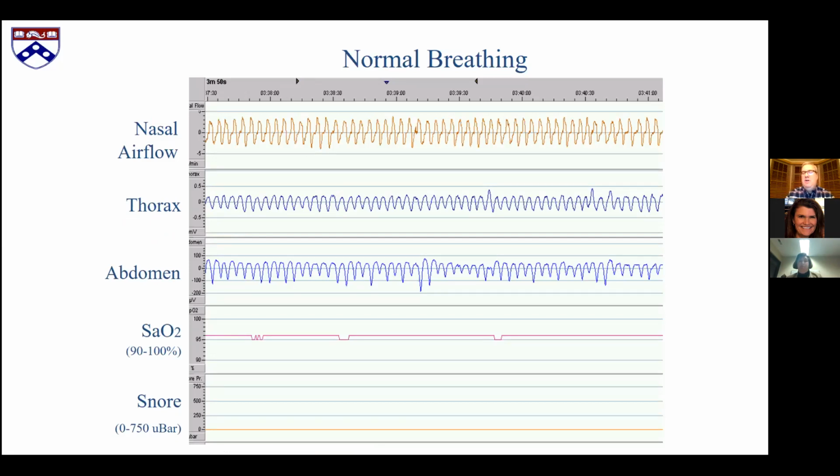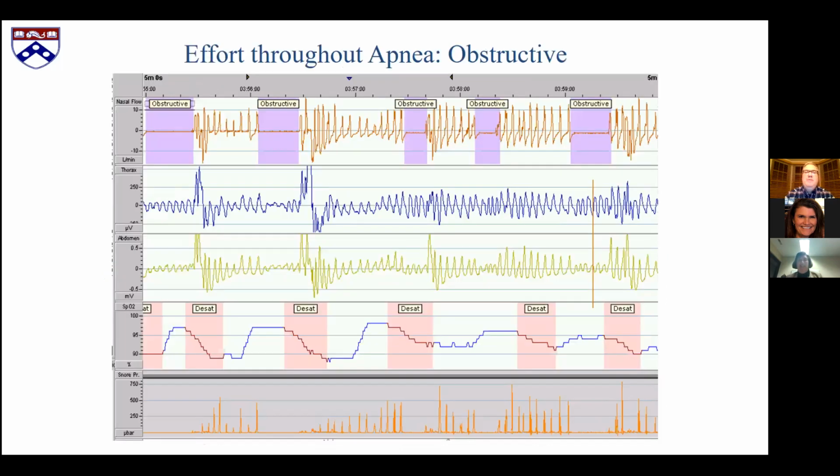And when I first saw this, I think Robin will be the one person to laugh. I always say I shocked that because as a cardiologist, when I see waveforms like that, I think torsade and I'm running in there with my magnesium, my calcium, and my defibrillator to save the day. But this turns out to be airflow, thoracic and abdominal movement. So this is an example of obstructive sleep apnea.